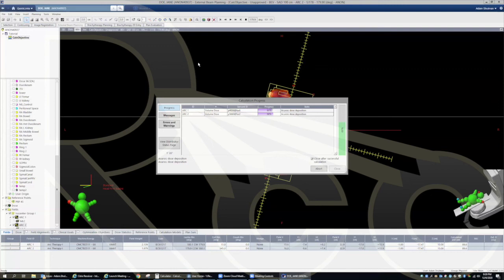For your lateral scatter, your model can better predict 6 MV than it can 10 MV, just because the secondary electrons will scatter further distances with your 10 MV, which is harder for your model. Now, if you have Acuros or Monte Carlo, either one will do a good job. Or if you're doing something like AAA, 6 MV will be a lot more accurate for your model. Collapsed cone is somewhere in between AAA and Acuros in terms of its ability to model that scatter.